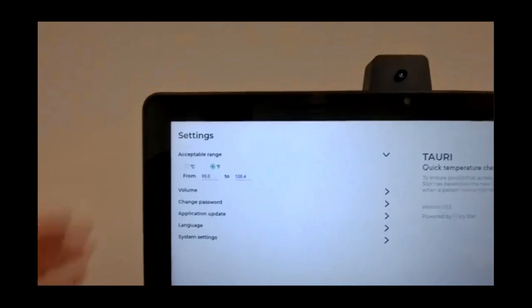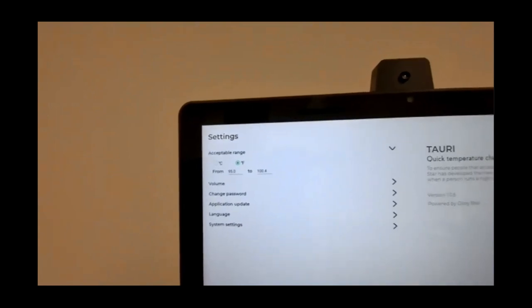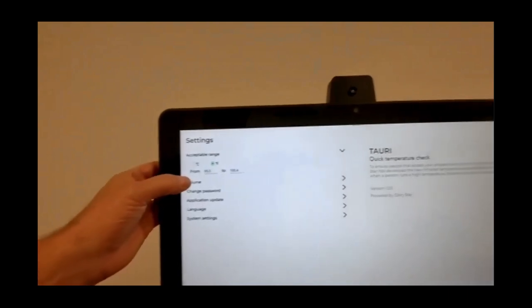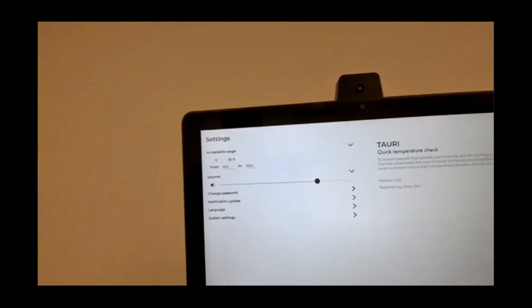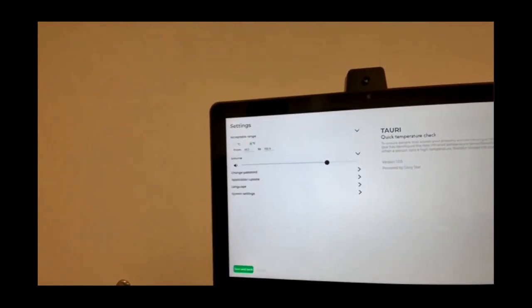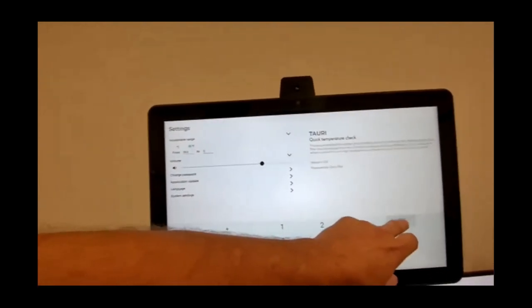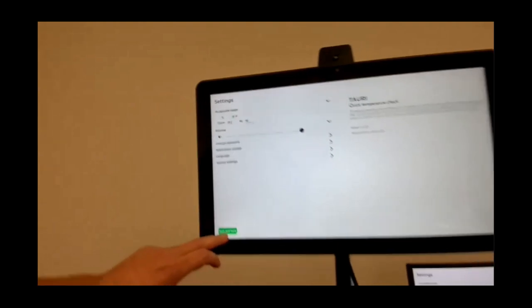On the settings screen we have options for Celsius or Fahrenheit. We're currently set to 95–100.4°F, with 100.4°F being where we trigger a high-temp alert. There's an audible component — we can ramp that up or down, all the way to mute. We can also adjust system settings like passwords, application updates over IP, and language. I'm going to drop the high-temp threshold to 96°F so I can demonstrate an over-temp condition.